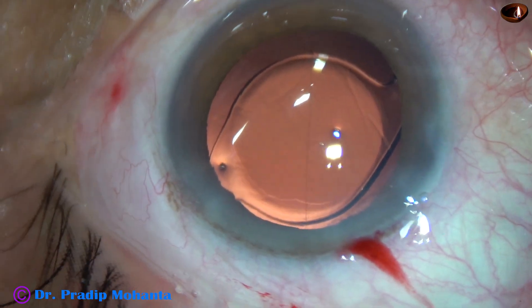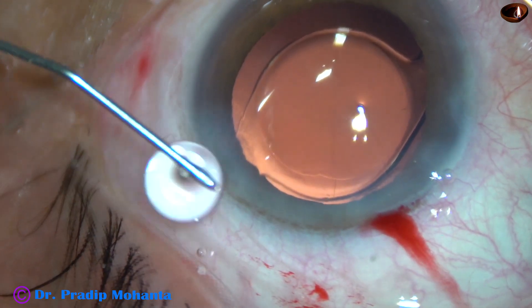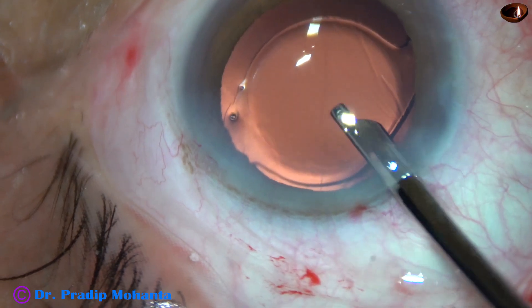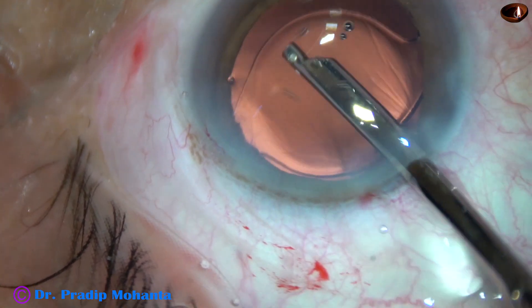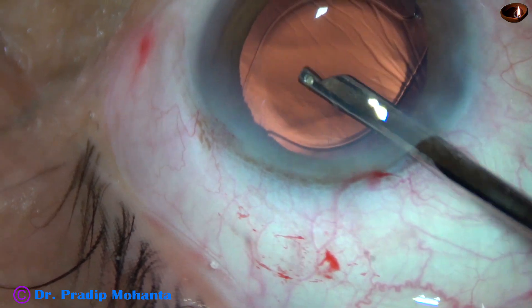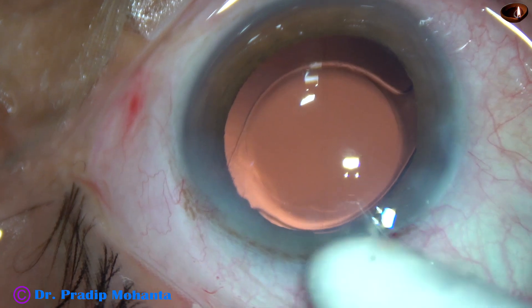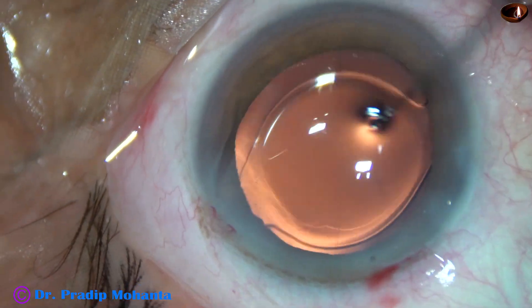This is a bit of moxifloxacin. Now the side port is closed by hydrating the corneal stroma. While hydrating the corneal stroma, we must inject fluid on the scleral side of the incision so that DMD — Descemet's membrane detachment — doesn't occur. This is the final lavage of the anterior chamber; at this time any viscoelastic sticking to the corneal endothelium is removed. The anterior chamber is formed very nicely. The integrity of all the wounds is checked by a cotton-tipped instrument. Five drops of moxifloxacin is applied to the ocular surface, and the case is concluded.